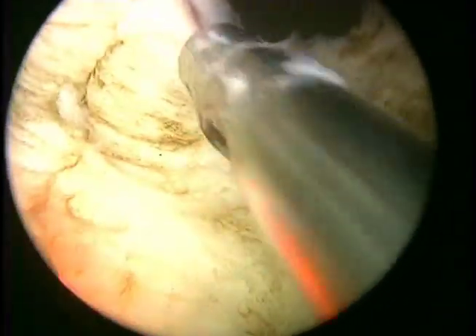This is typically first visualized near the bladder neck, where the level of the transition zone is thinnest. And as we come back, it becomes thicker, and this is why it's very important to really make sure that capsular groove is made from the bladder neck down to verum montanum.